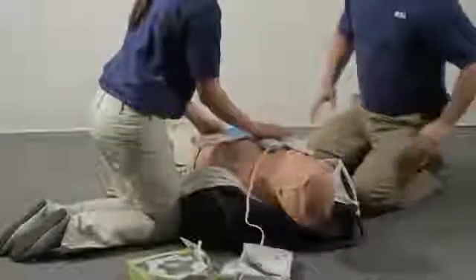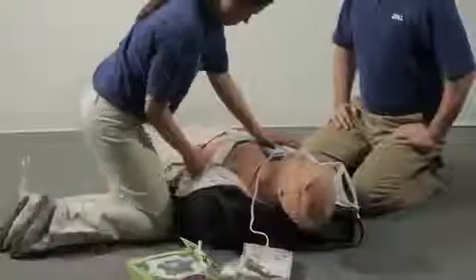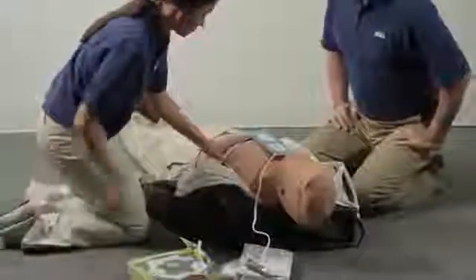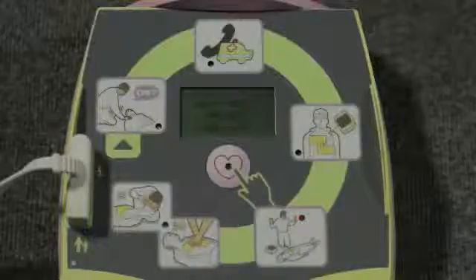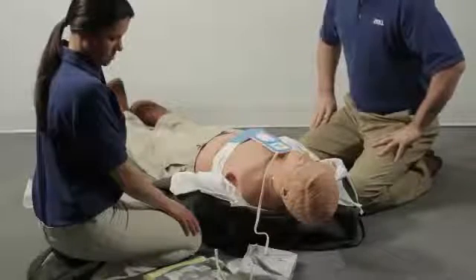As soon as they are applied, the AED Plus will begin analyzing the heart rhythm. It will not prompt you to do what has already been done prior to attaching the pads. Don't touch patient. Analyze. Don't touch the person while the AED is analyzing the heart.